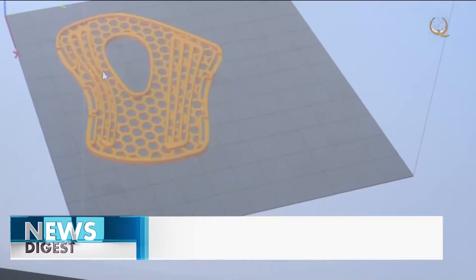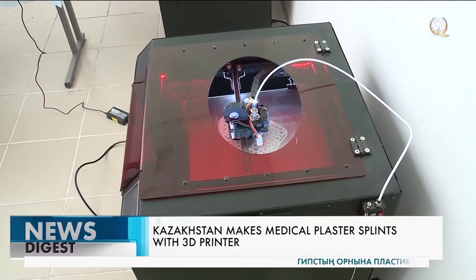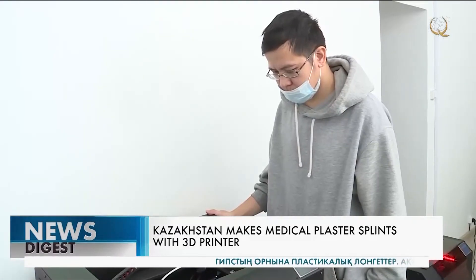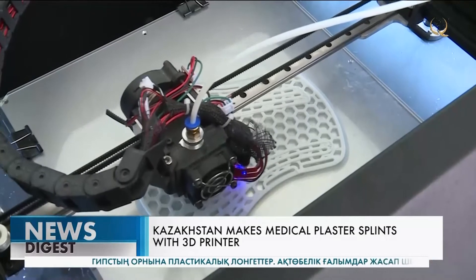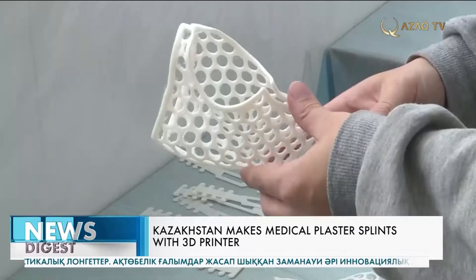A Medical University in Aktobe has started to print plaster splints. Such bandages made with a 3D printer can be used instead of plaster for broken arms and legs. According to scientists, the plaster splints are not only convenient, but also much lighter and several times stronger than plaster.